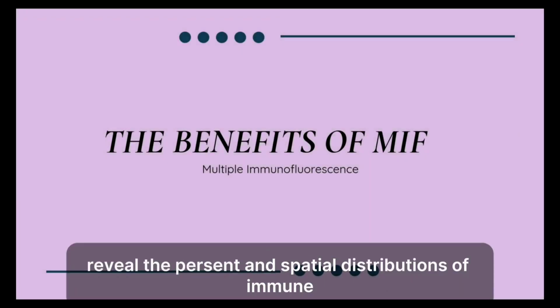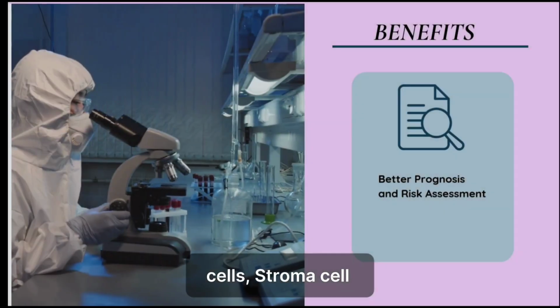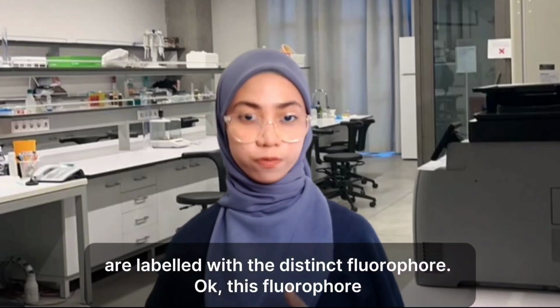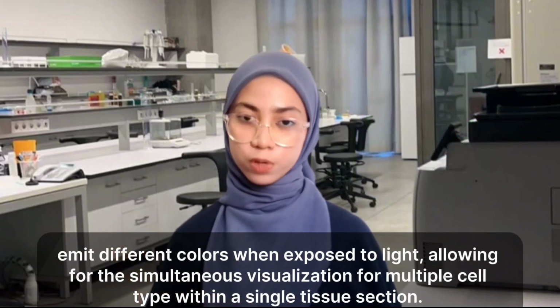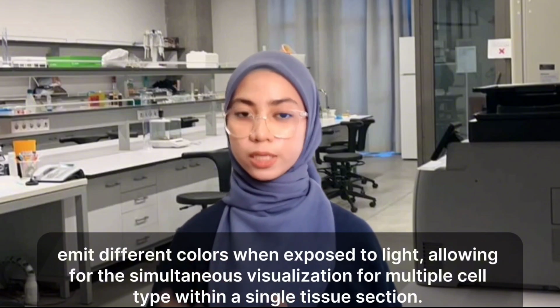The MIF method reveals the presence and spatial distribution of immune cells, stroma cells, and cancer cells by using antibodies specific to each cell type, which are labeled with distinct fluorophores. Okay, these fluorophores emit different colors when exposed to light, allowing for the simultaneous visualization of multiple cell types within a single tissue section.